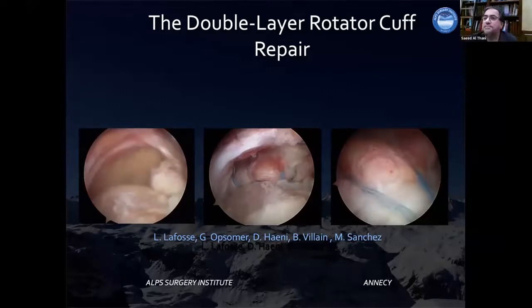It's very important not to rush to the repair, but to expose the shoulder. A key point I want to underline is that we neglect a lot of cuff tears and deep layer tears due to the fact that everybody is starting to do the shoulder arthroscopy from the back.